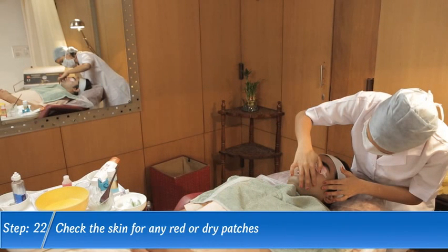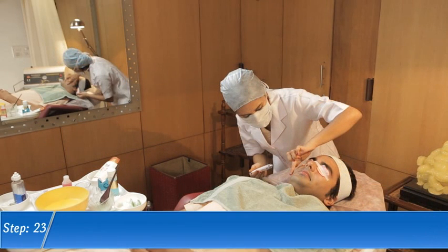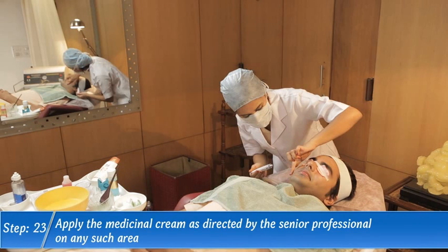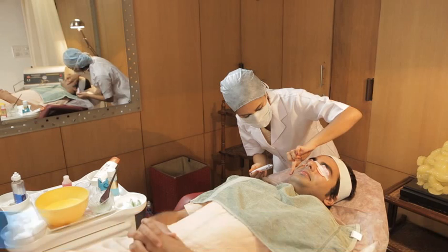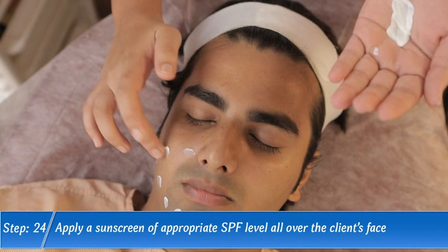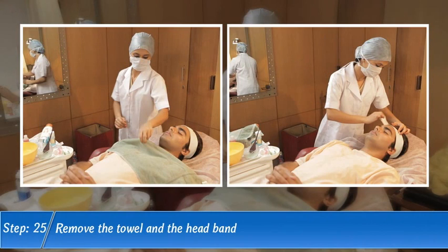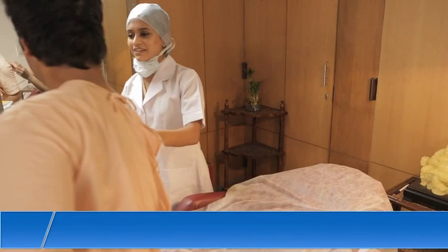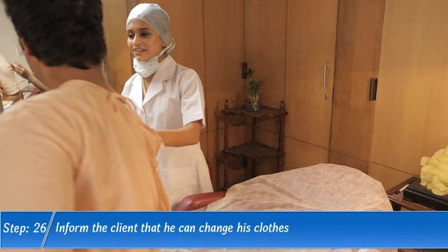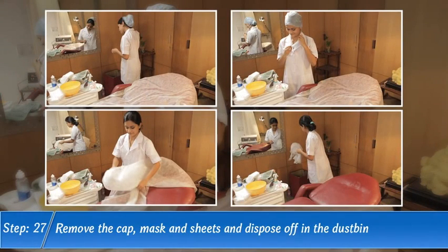Step 22. Check the skin for any red or dry patches. Step 23. Apply the medicinal cream as directed by the senior professional on any such area. Step 24. Apply a sunscreen of appropriate SPF level all over the client's face. Step 25. Remove the towel and the headband. Step 26. Inform the client that he can change his clothes. Step 27. Remove the cap, mask and sheets and dispose of in the dustbin.